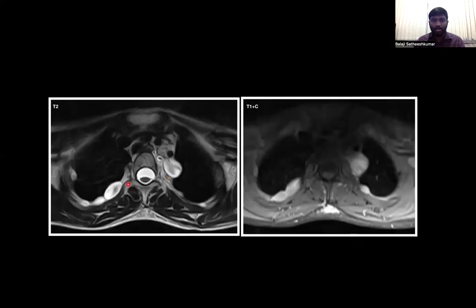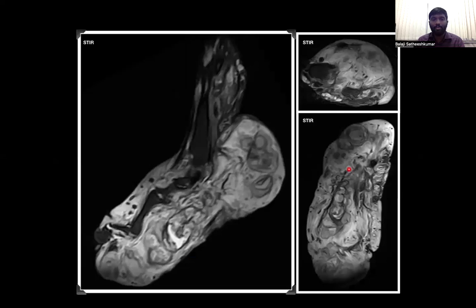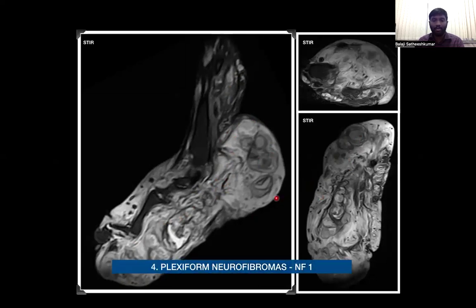The same patient showed multiple T2 hyperintense lesions involving both sides of the ribs, which showed mild to moderate post-contrast enhancement suggestive of intercostal nerve neurofibromatosis, and also we see the mediastinal extent of the neurofibromatosis. Moving on to the next case, here we see diffuse thickening of the skin and subcutaneous tissues of the entire foot and the distal aspect of the leg, which shows multiple STIR hyperintense lesions with hypointense foci, suggestive of plexiform neurofibromas, NF1.